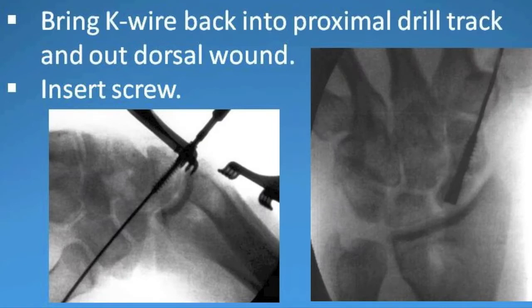At this point, we pass the guide wire back across the nonunion site and out the dorsal wound. The pre-measured screw is inserted, and we basically wait for healing.